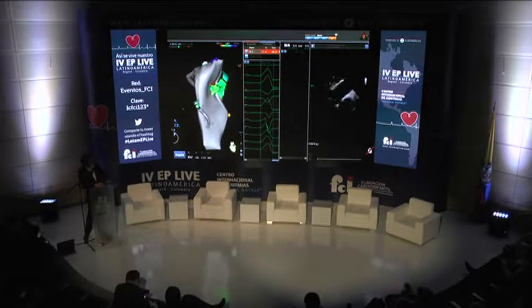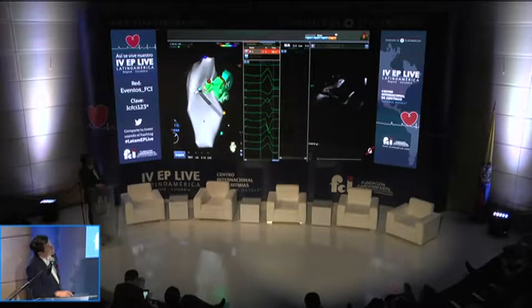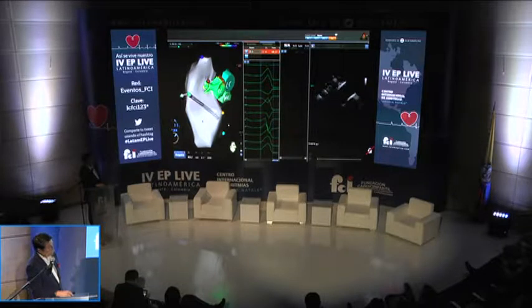Luis, to close the topic on whether we would apply on the site where we were. When we started the case, we started by mapping the right side. We did start doing that, but on the right side, there were very few extrasystoles, and the ventricular excitability was really very important. So since there were no extrasystoles, we did a couple of pace maps which weren't very good.